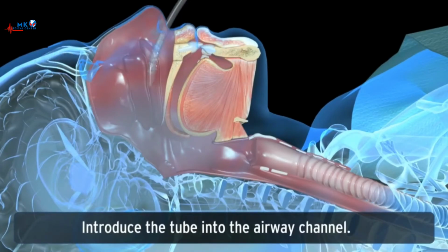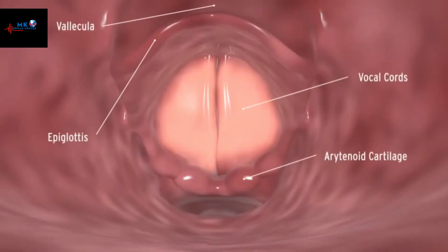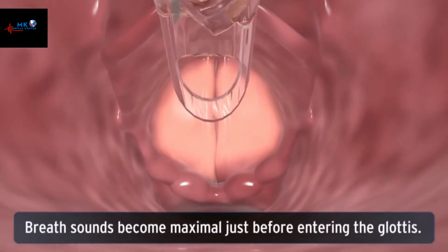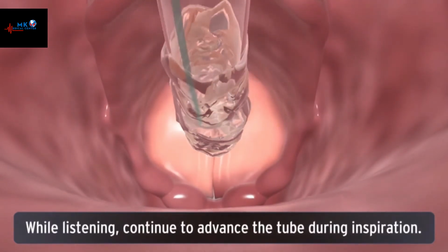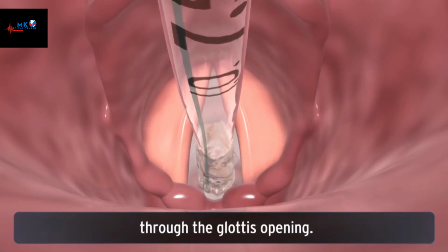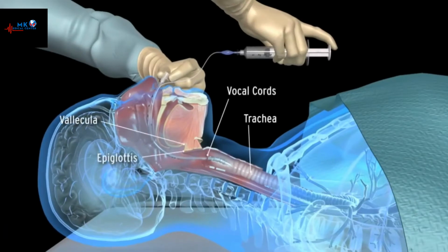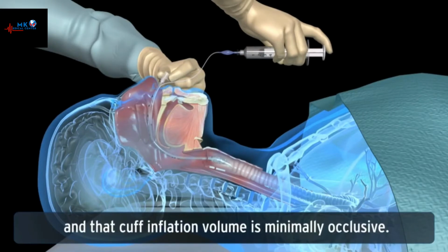Introduce the tube into the airway channel. Breath sounds become maximal just before entering the glottis. While listening, continue to advance the tube during inspiration. Inspiration facilitates movement of the tube through the glottis opening. Ensure that there is no air leak and that cuff inflation volume is minimally occlusive.